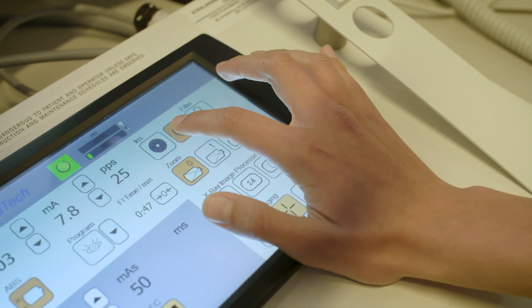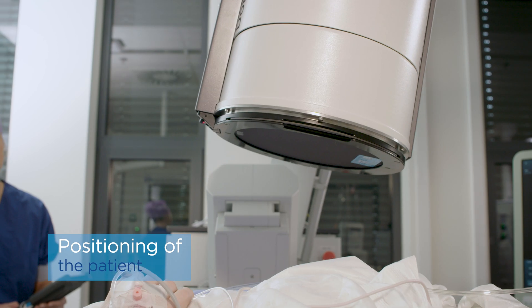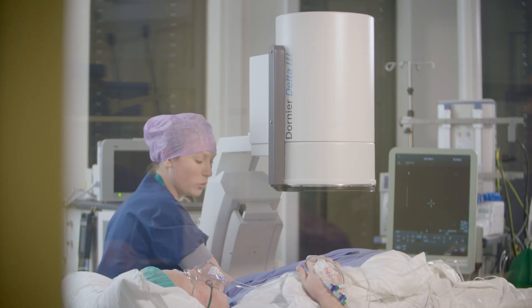Also, within our remote control room we have a screen on which the X-ray or ultrasound image is projected. So the setup of our remote control room is very convenient for us.